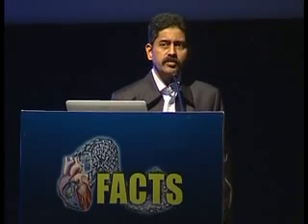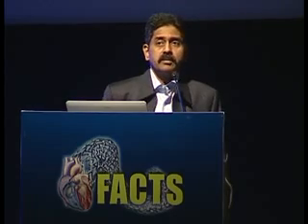Now they're ready at CARE, the patient is on the table. We'll go live to CARE and we can have any discussion during the sessions. We'll have a renal denervation and a structural heart case coming up.